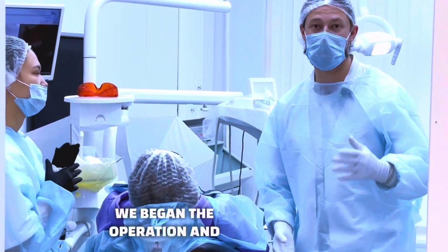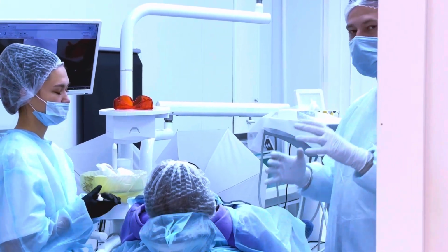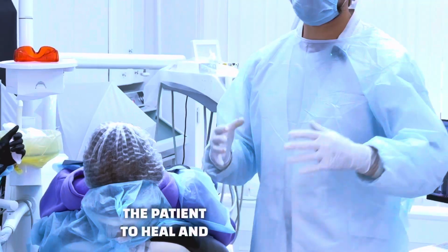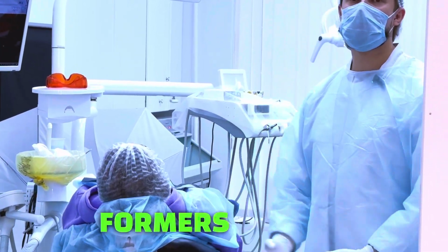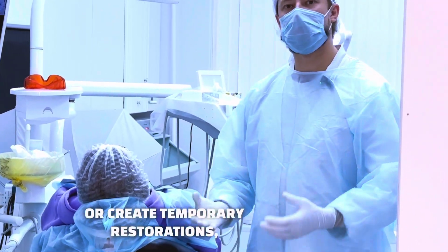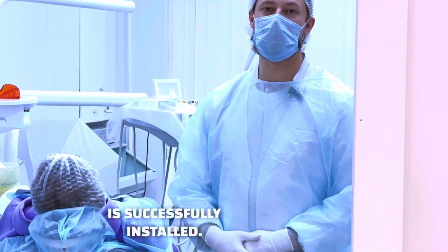We began the operation and installed 3 perfectly aligned implants using a surgical template. Now, we'll leave the patient to heal and allow osseointegration to occur. Next, we'll install gingival formers or create temporary restorations, followed by the final work. That's our future plan. For now, the implant is successfully installed.